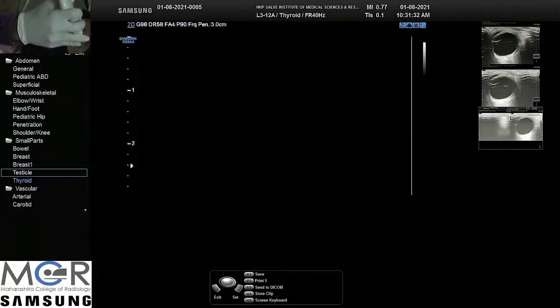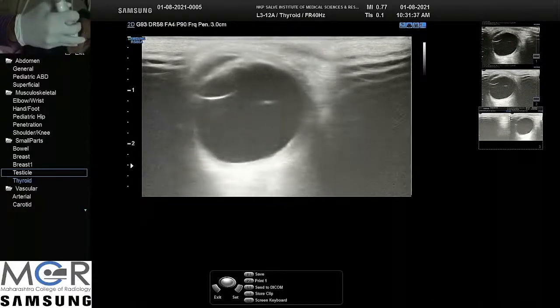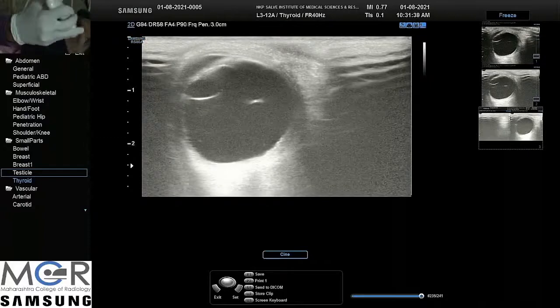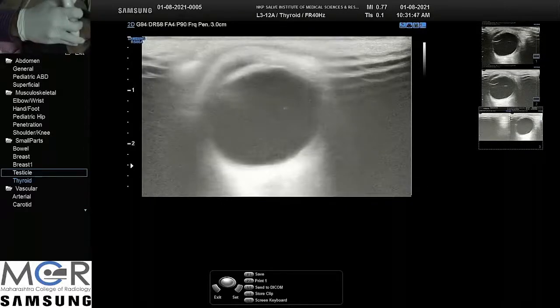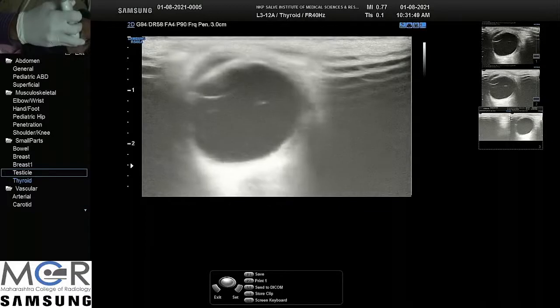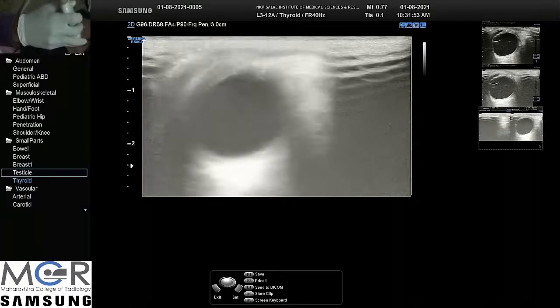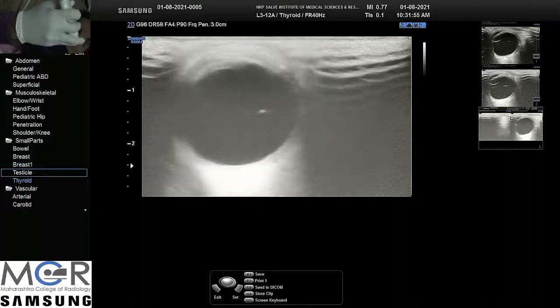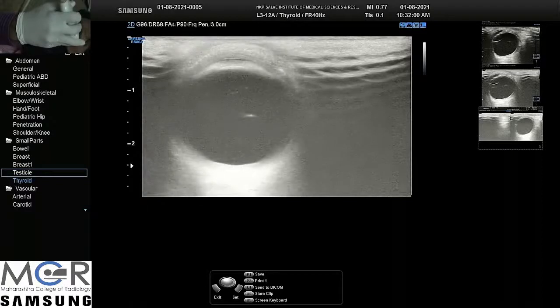Okay. So in this case, the anterior chamber is normal for us. There is a small echogenic foreign body in the posterior vitreous, measures around 2 millimeters, and it shows some mobility or change in position on eye movement. Move the eye once again. Move. Yes, see that it is moving.